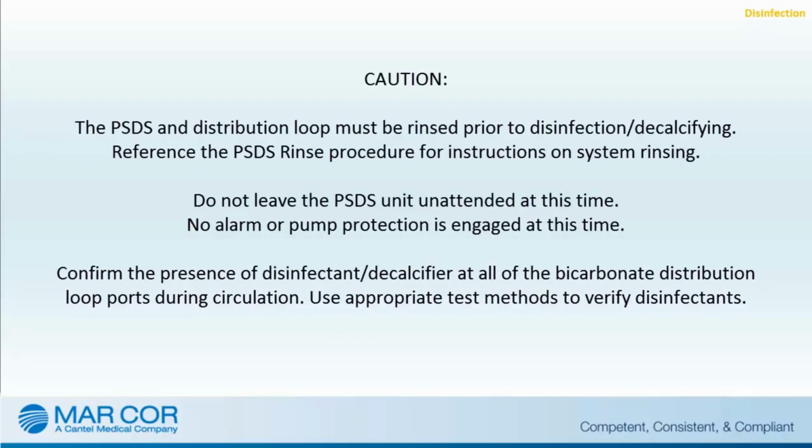Caution: the PSDS and the distribution loop must be rinsed prior to disinfection, decalcifying. Reference the PSDS rinse procedure for instruction on system rinsing. Do not leave the PSDS unit unattended at this time. No alarm or pump protection is engaged at this time. Confirm the presence of the disinfectant decalcifier at all of the bicarbonate distribution loop ports during circulation. Use appropriate test methods to verify disinfectants.